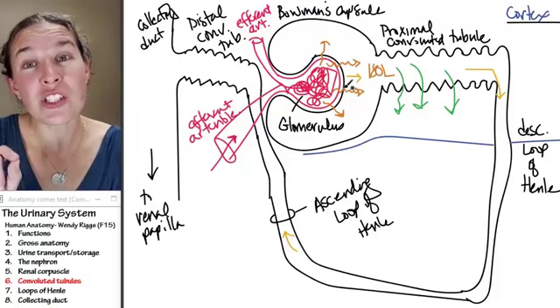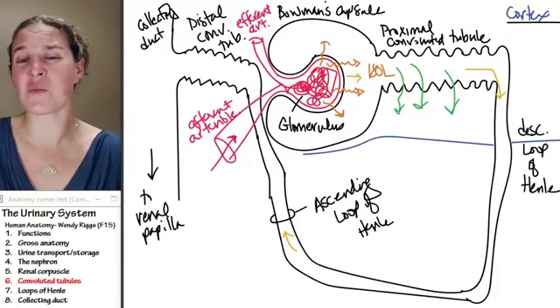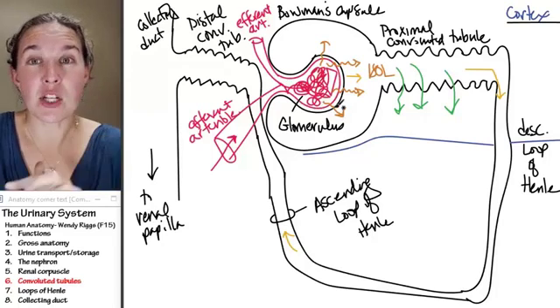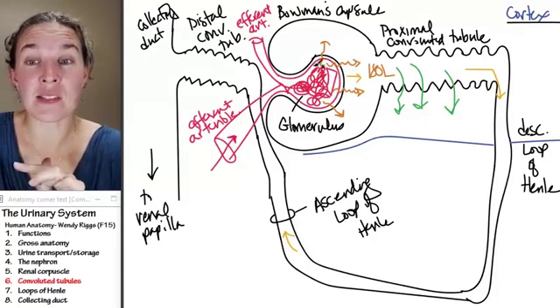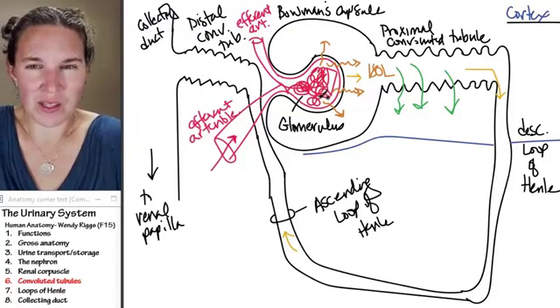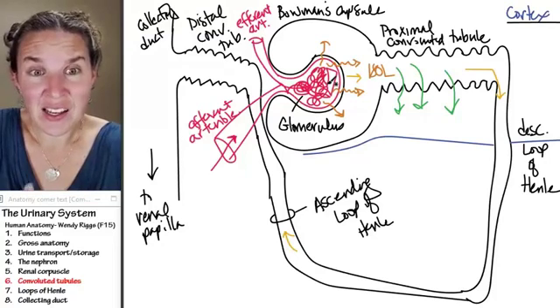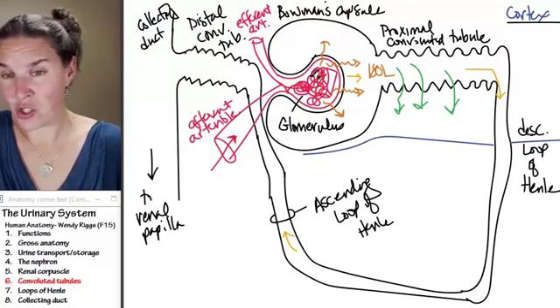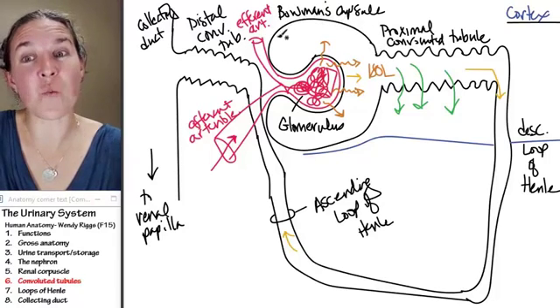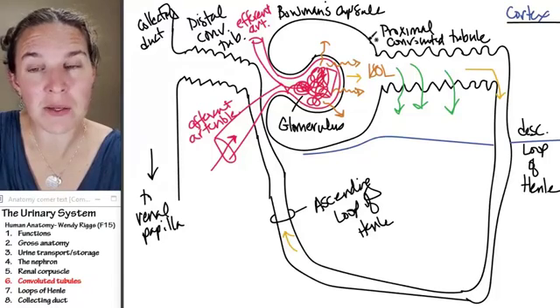That's what a kidney is. So we're looking for some sense of what is all this? We're going to look for glomeruli. I'm going to show you a slide in a second that's going to show you what the glomerulus looks like. And we already know what the glomerulus looks like because we targeted in on that 20 lectures ago when we looked at simple squamous epithelium, which is what the parietal layer of Bowman's capsule is made out of.